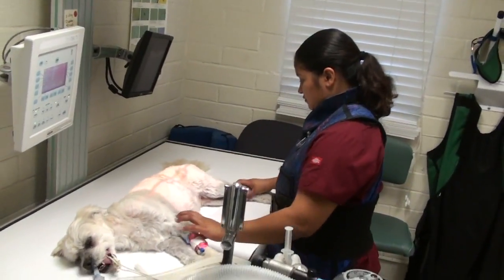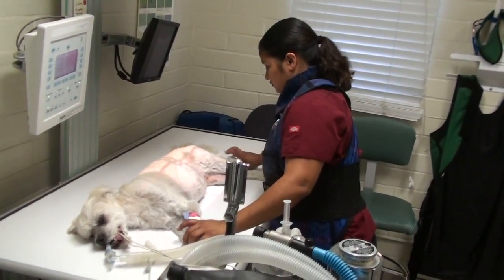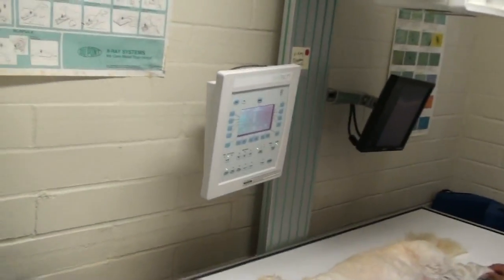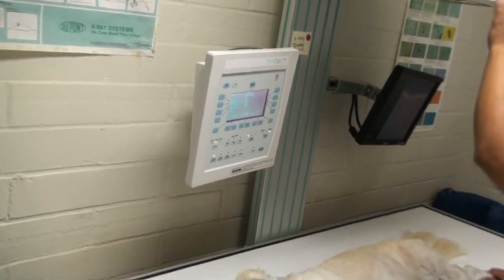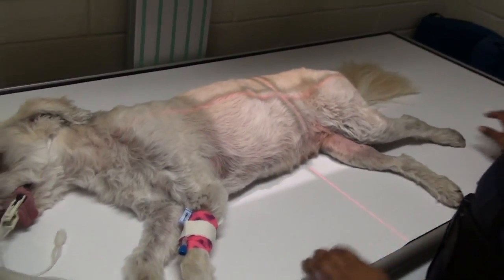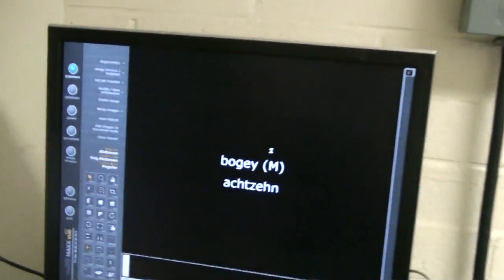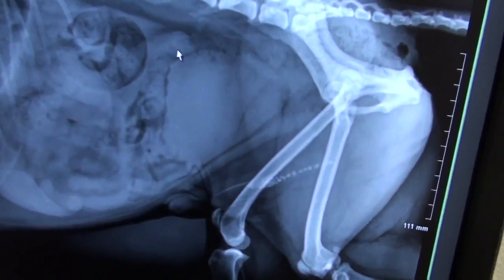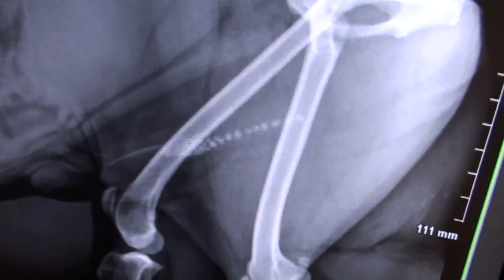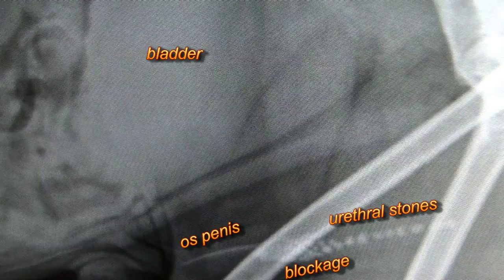Isabel's wearing a protective shield and the lead apron for taking x-rays. She's going to put in the right settings. Then it comes up on the screen. You can see all the little stones in the urethra. In the x-ray, you can see all the little urethral stones lined up like billiard balls, and they get stuck by the bone of the os-penis.